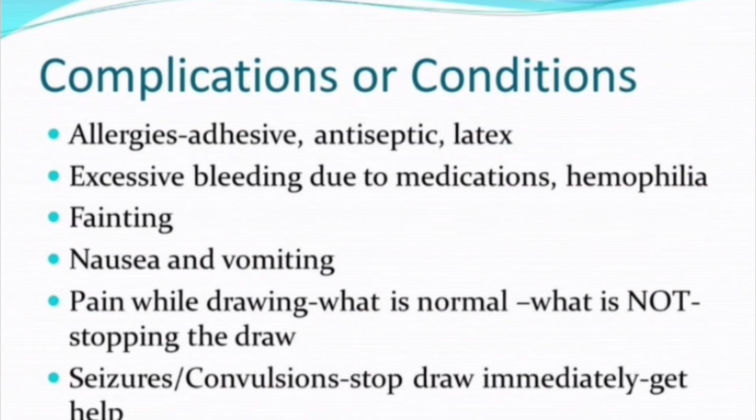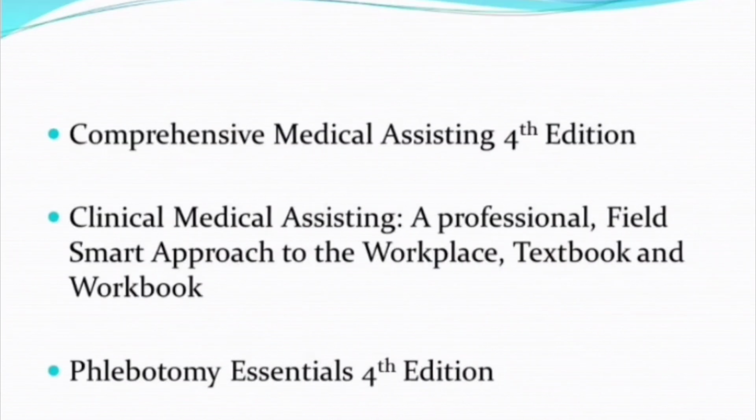Complications or conditions: allergies, adhesive or antiseptic, latex, excessive bleeding due to medications, hemophilia, fainting, nausea and vomiting, pain while drawing. What is normal, what is not, stopping the draw. Seizures, convulsions: stop the draw immediately, get help.